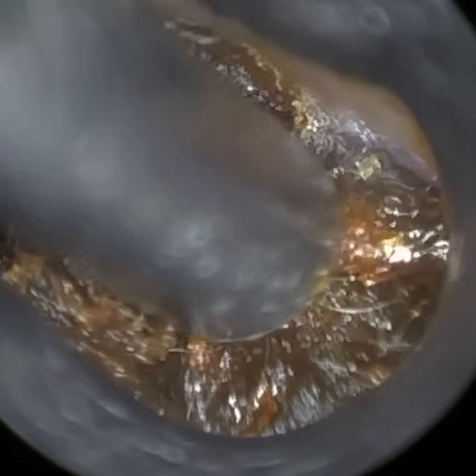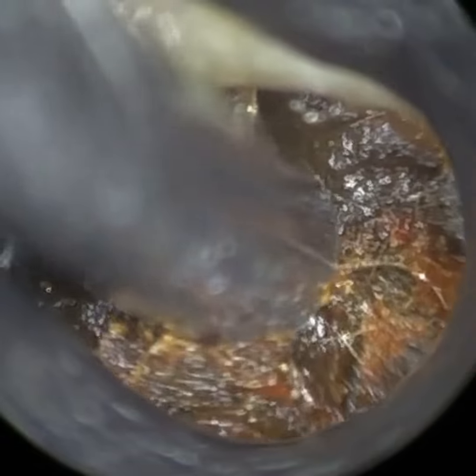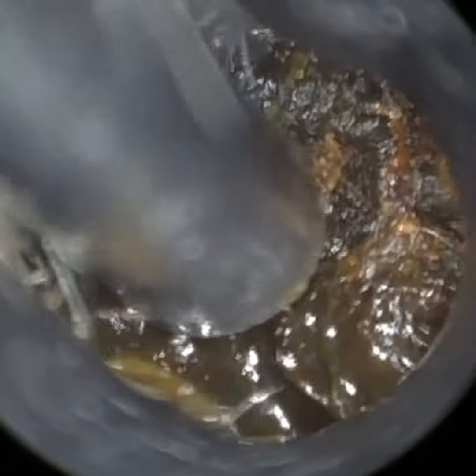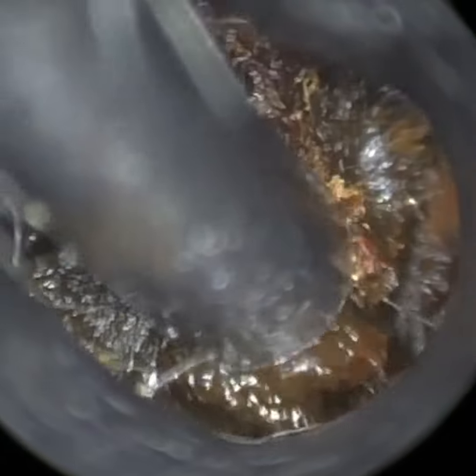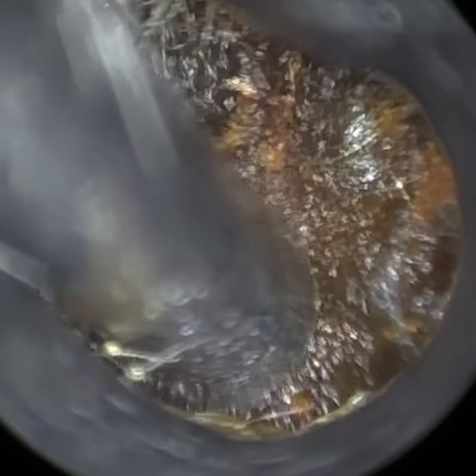This patient's got quite a narrow ear canal entrance, but you can just see how much we've widened it using the Waxscope. I'm using the 4.25mm speculum. We've got a smaller size of 3.5mm, and two larger sizes of 5mm — which is probably going to be the standard size — and the 5.75mm.